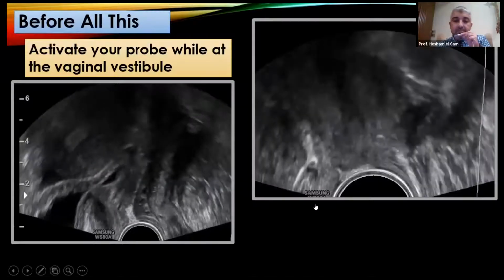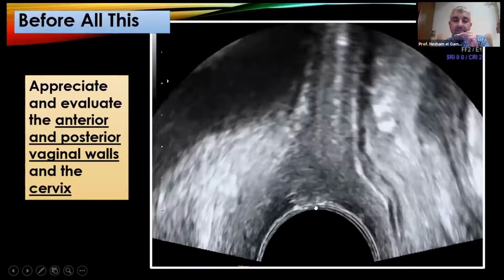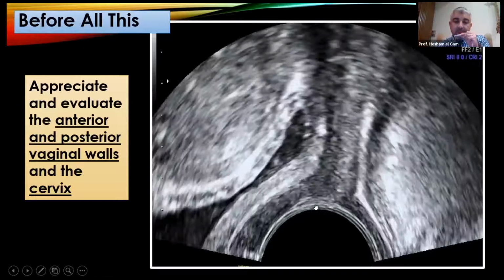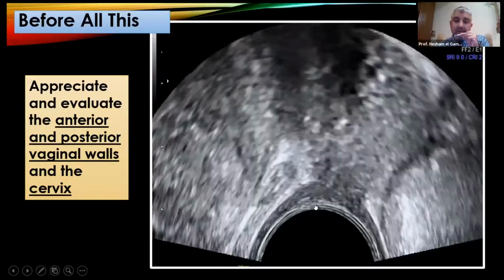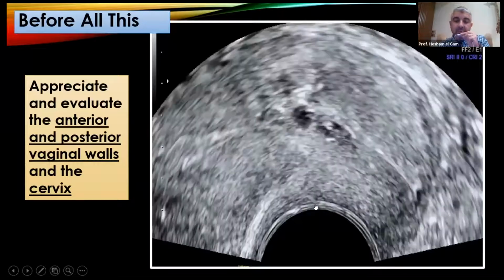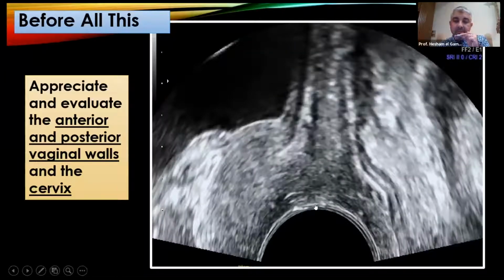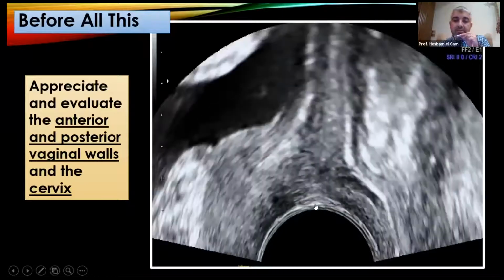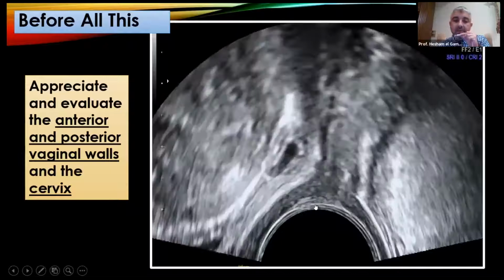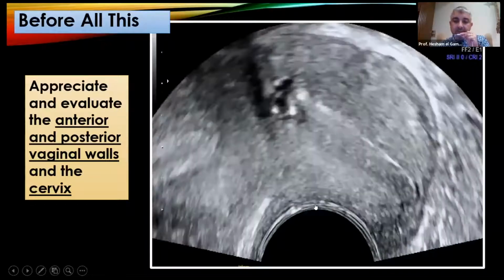And you should not miss a lesion that would be present in the vagina or in the cervix while performing such a scan, especially prolapsed polyps or submucous myomas that have prolapsed into the vagina. Of course, doing a speculum examination will give you an idea about the diagnosis, but not to miss them with an ultrasound scan is better by performing your scan just outside the vagina.